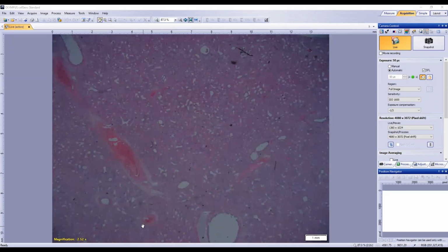And then I would go for the pleural surface. Similar kinds of things in the pleural surface: the connective tissue, is there any infiltration or granulation tissue formation, thickening, how much thickening, fibrin deposition or not, inflammatory cells, what kind, that sort of thing. Yeah, that was the most wonderfully detailed description ever. You rocked that. That's awesome.